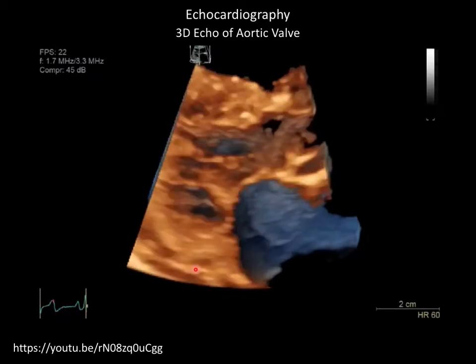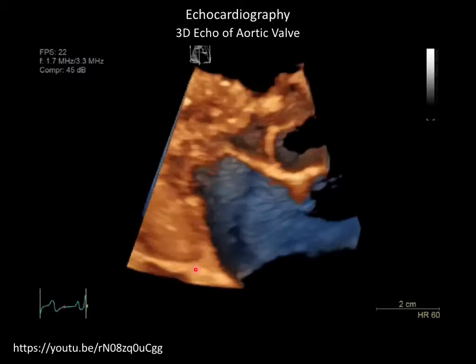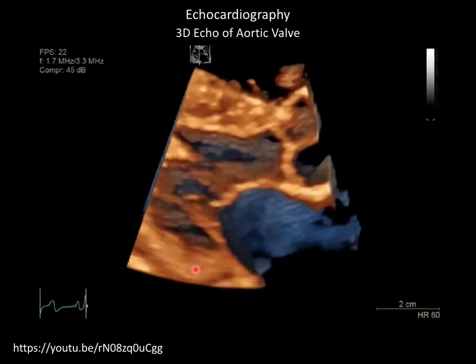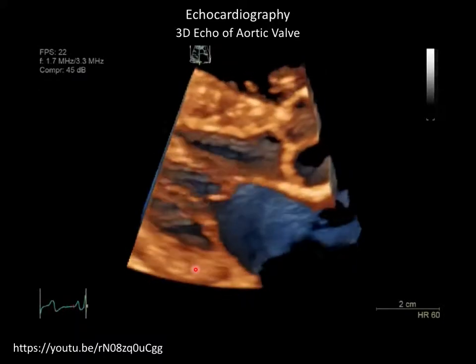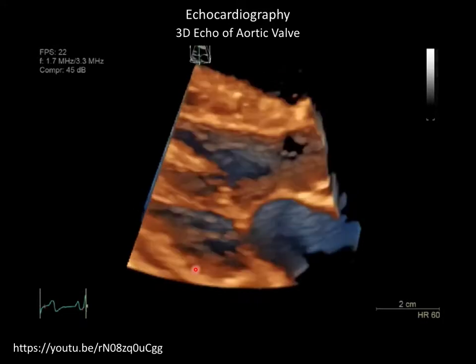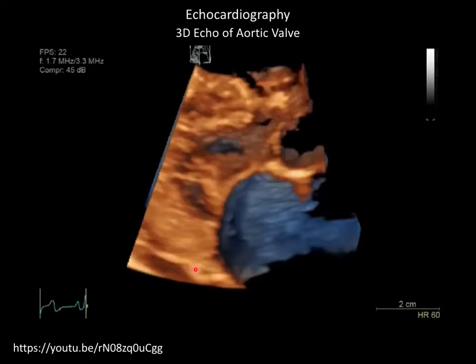That seems like a pretty bold assumption, that each heartbeat the motion is identical. But the assumption is true in a normal heart where you don't have arrhythmia and things like that, down to probably a couple of millimeters, right, down to 2 millimeters, something like that, 2, 3, that the heart will go back to the same pose on each beat.